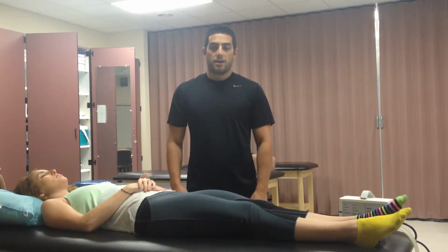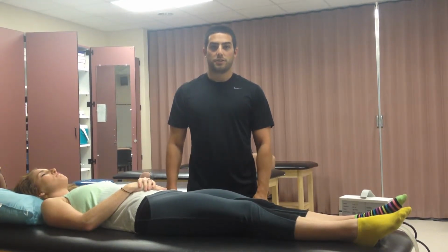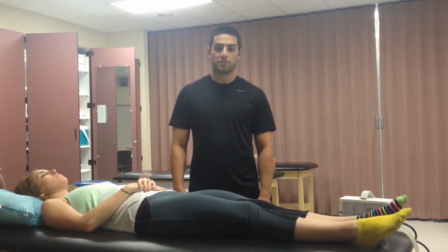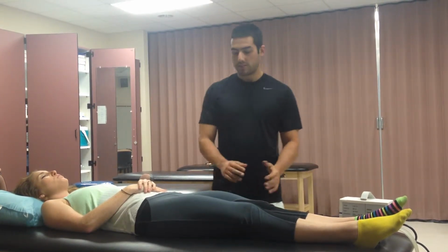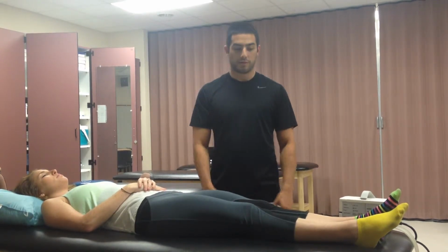revascularization. Precautions for intermittent compression are impaired sensation or mentation, uncontrolled hypertension, cancer, stroke, or superficial peripheral nerves in the area. So once I've cleared her for contraindications and precautions, I'm going to begin setting up the treatment.